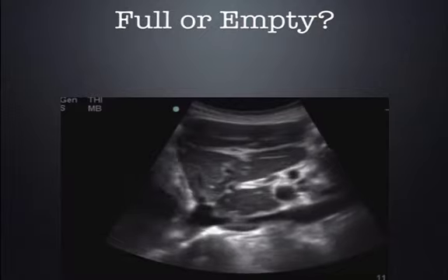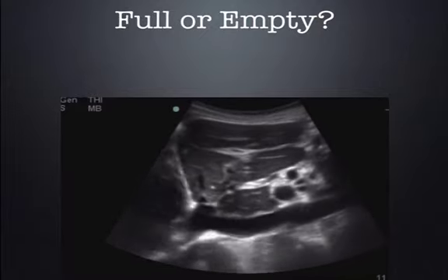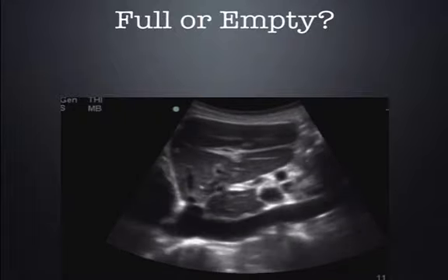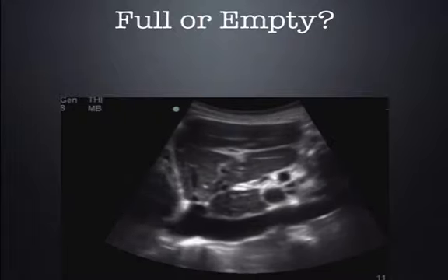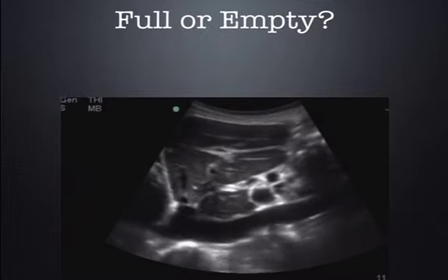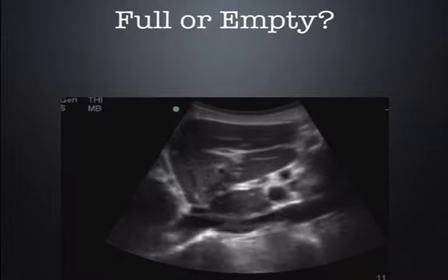In this case, just looking at it, doing kind of a qualitative analysis, which is all you really need to do, I'm not an advocate of measuring the IVC and getting exact numbers. Just look at it and say it's approximately a 50% collapse with inspiration. What do we do with this IVC here?